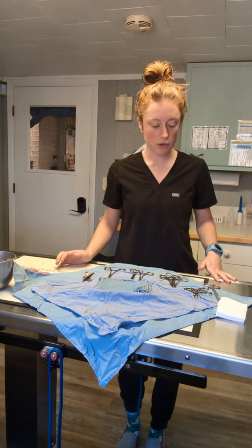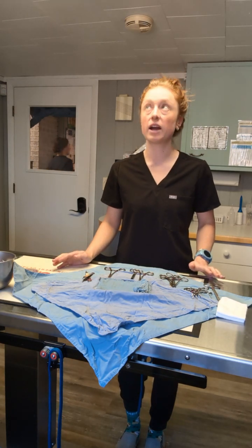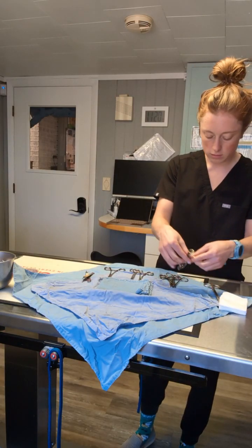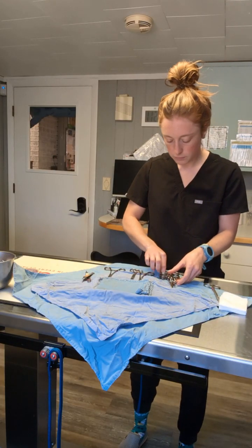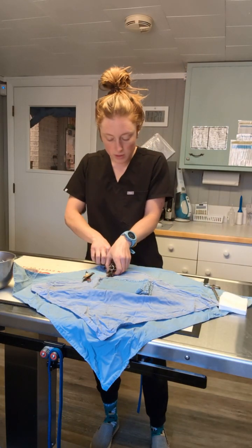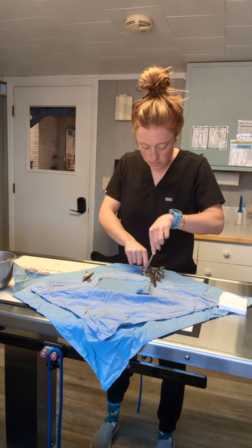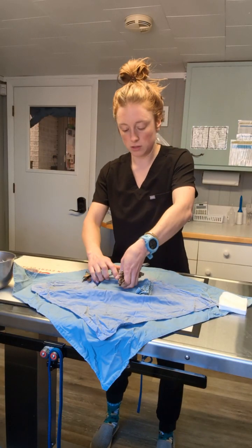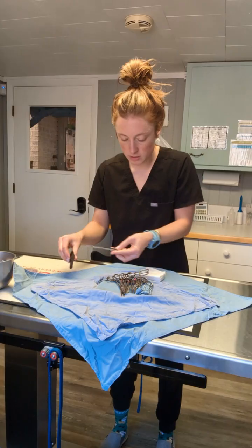To wrap a sterile surgery pack, I've got all my materials laid out. This is a laceration pack, so I'm just gonna stack everything in order of size. So I want smallest on top, and I'm making sure to line up the loops of all of the materials. I'm just gonna insert this through all of them, and I'm just gonna stack everything on top, trying to keep everything as compact as possible.